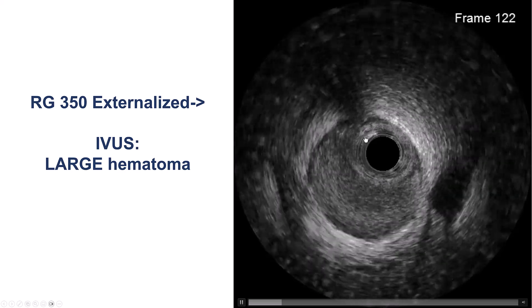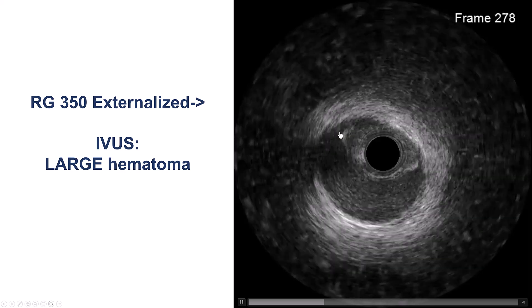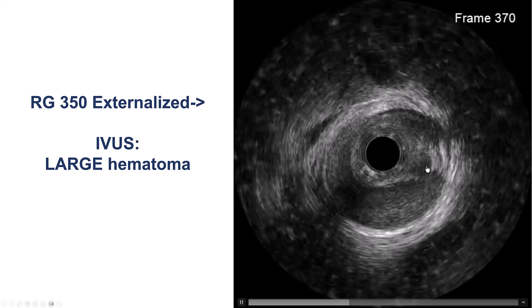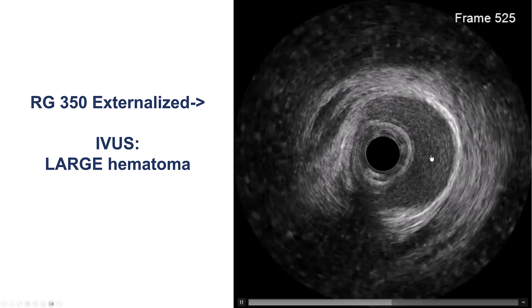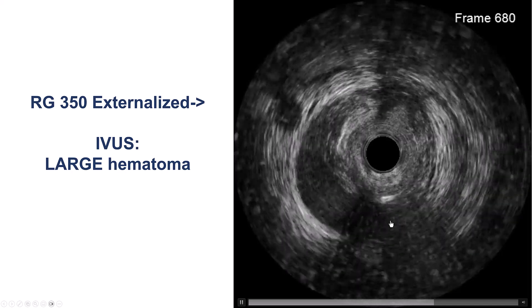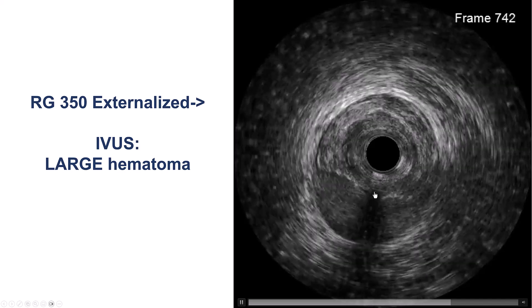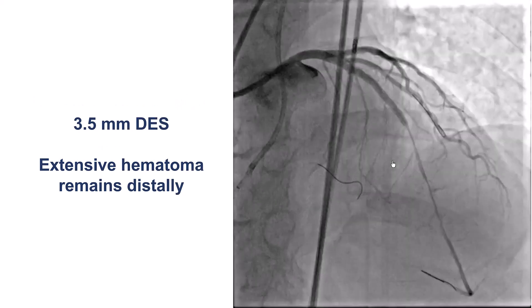We externalized with an RG3 350 wire and then performed IVUS, which revealed a very large hematoma. Unfortunately, all the antegrade and retrograde attempts resulted in a fairly large hematoma into the LAD — the LAD was literally swimming within a large extraplaque hematoma. We decided to stent in hopes that this would tack back the hematoma. It looked good in the stented segment, but the distal segment still appeared fairly compressed.